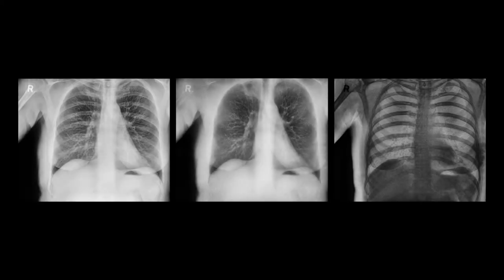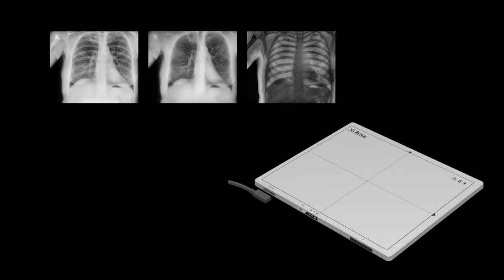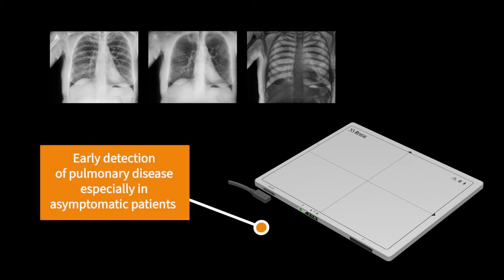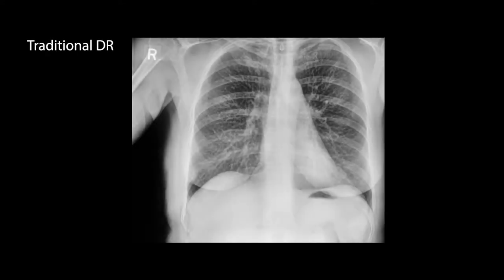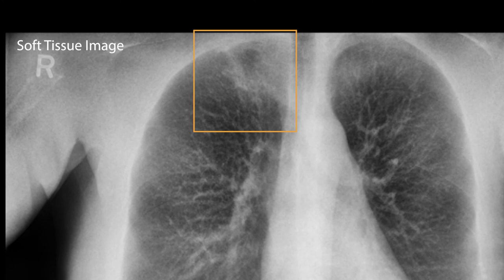This case highlights the possibility of using KA Imaging's Reveal device in place of conventional x-ray imaging for the early detection of pulmonary disease, especially in asymptomatic patients who are either not clinically indicated to receive a CT scan or lack access to a CT scan facility. To emphasize, the apical lesion in the right upper lobe that was missed in the conventional PA x-ray image became visible in the soft tissue dual energy x-ray image.